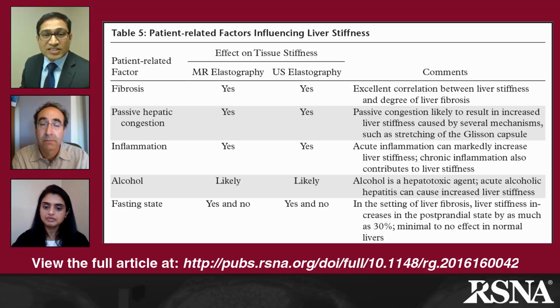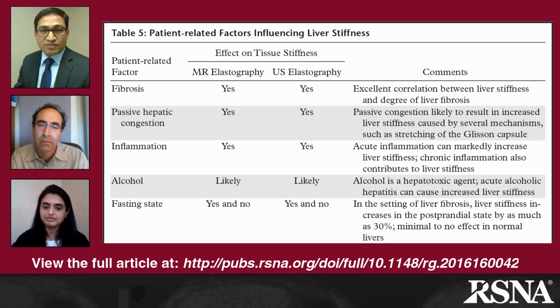But a fibrotic liver is less compliant. It cannot distend much, so when this increased flow comes, it gets stretched. The capsule gets stretched, as a result of which the stiffness increases. So if you measure the stiffness in a postprandial patient who has fibrosis, the stiffness is going to be higher than when he is in a fasting status. It is very important that patients should always be scanned in a fasting status, and fortunately, clinically, we always scan patients fasting. This should not be a problem, because a fasting status of at least a minimum of 3 to 4 hours should be easy to follow.